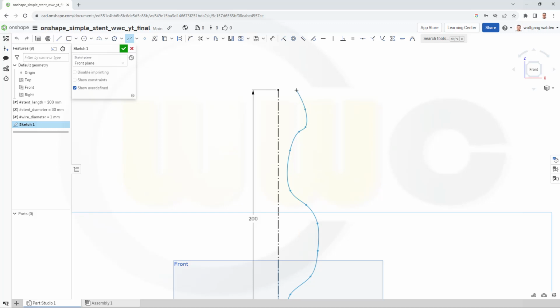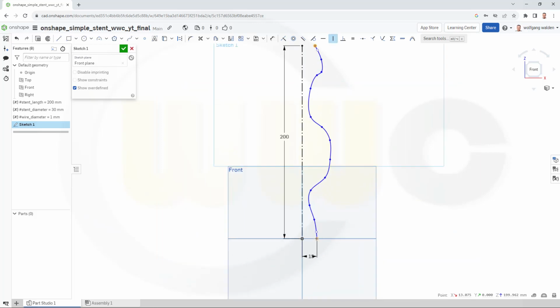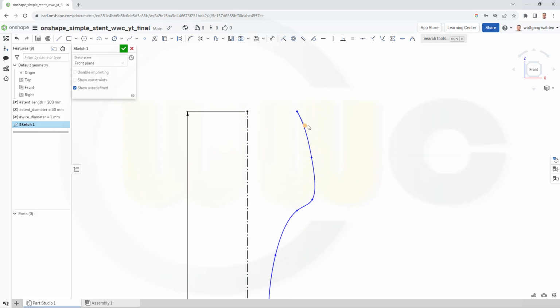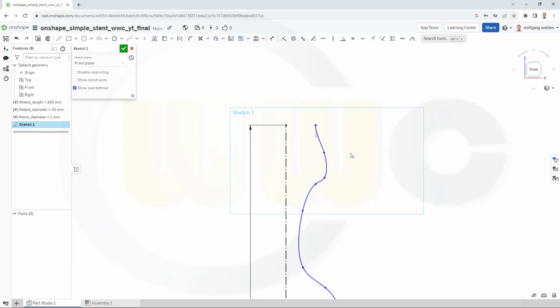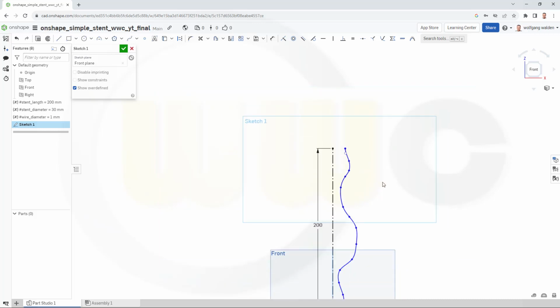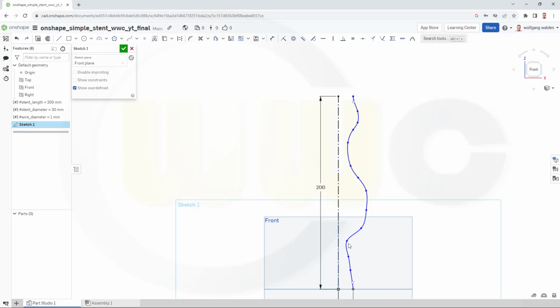up, and this here should probably be the same distance as the one below. So I could align this point vertical with that one here. Yeah, let's take a look if that is okay. Yeah, that's okay. Maybe put it like this and maybe move the point, adjust it a little bit, whichever way you want it to be, maybe like that. Okay, and maybe move this a little bit as well, maybe like that. Doesn't really matter. And confirm that sketch.